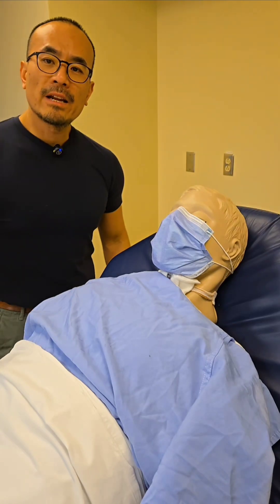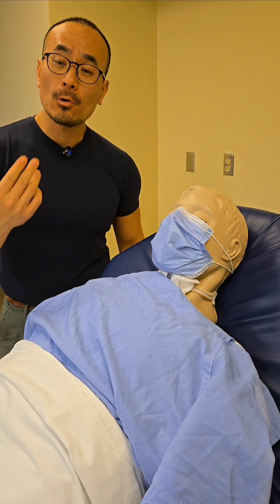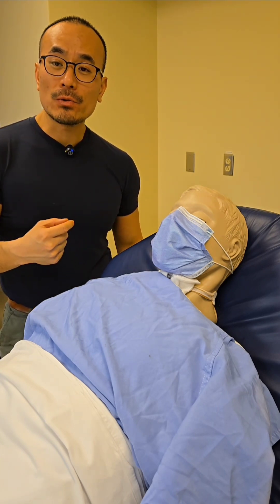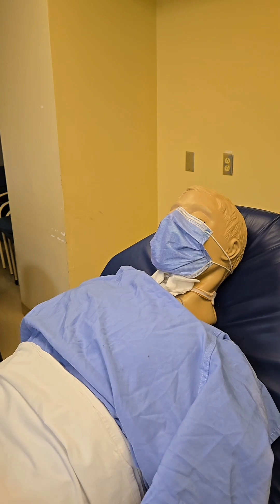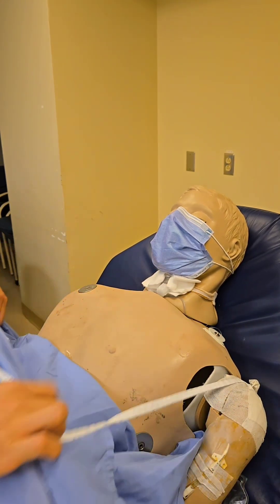When doing any procedures that include accessing central lines or a portacath, always make sure the patient is wearing a mask so that it minimizes the risk of contamination at the site. Our patient is already wearing a mask, so we're good to go. Let's start by exposing the patient after we have explained the procedure.